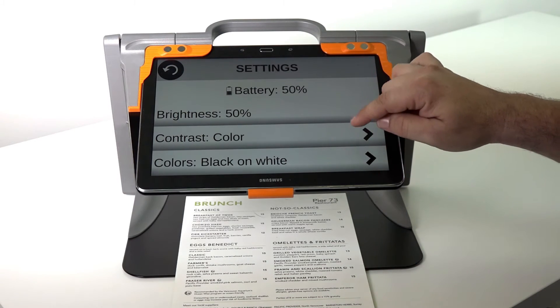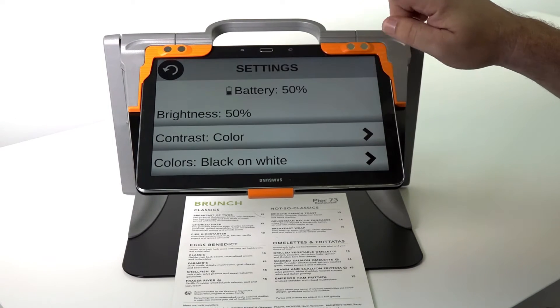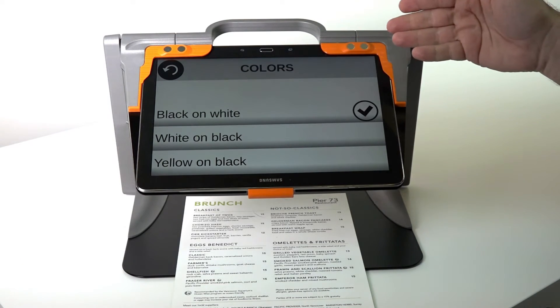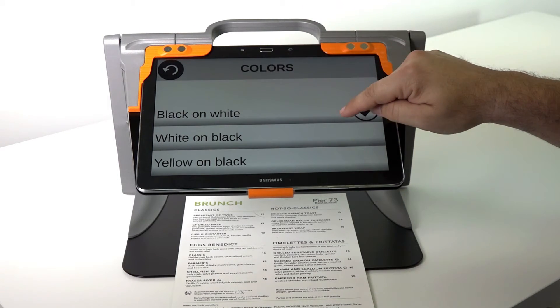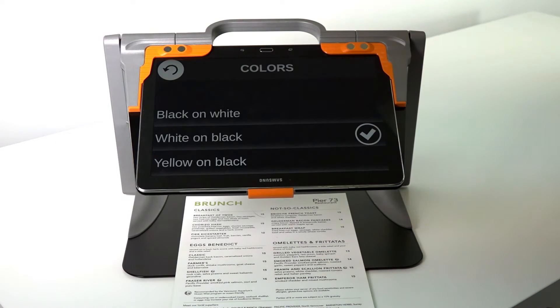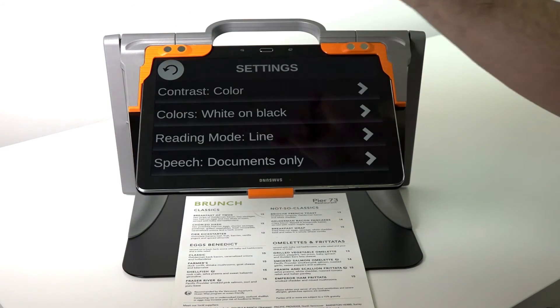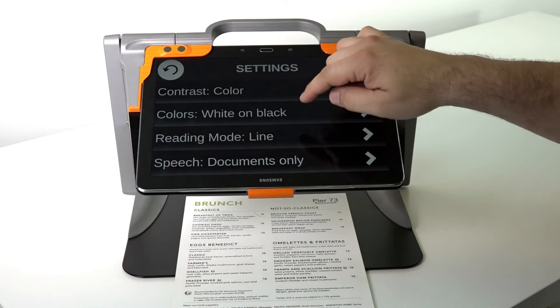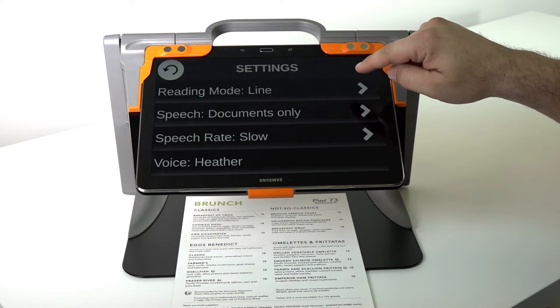Now, being that this is a 12-inch touchpad, I can move upwards or downwards and tap anywhere on the screen to the setting I like. For example, the colors — at this time I'm set on black on white. If I wanted white on black, I'd simply tap on it. The color scheme appears automatically, and when I'm finished I'll press the back button and it brings me back to my full level of settings.